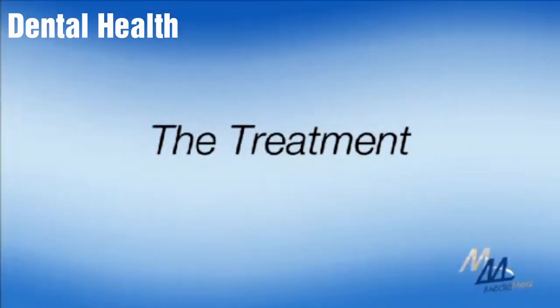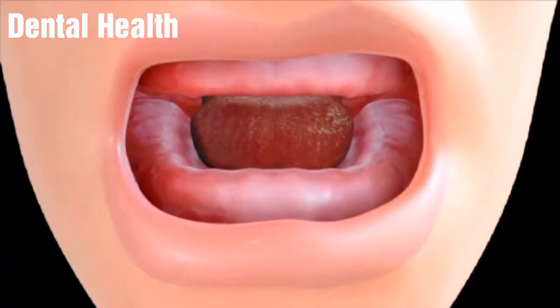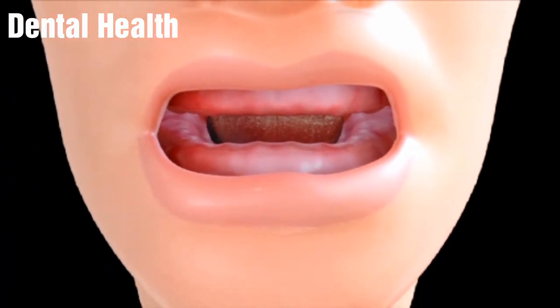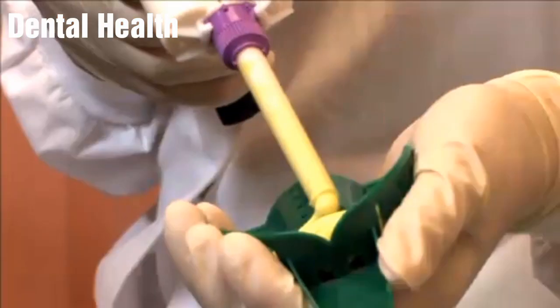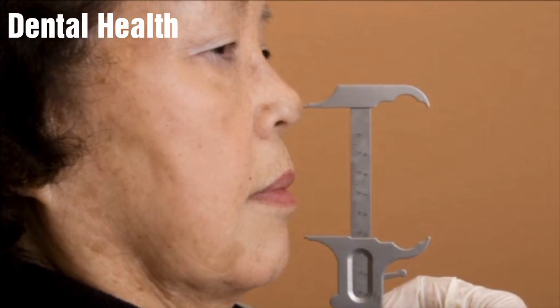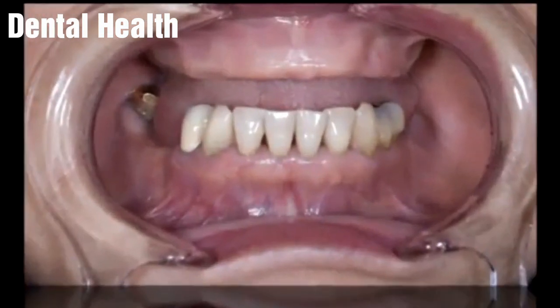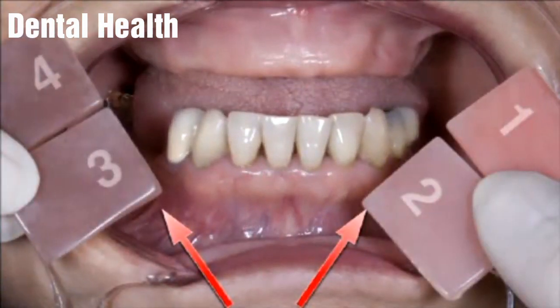Complete dentures are made using your mouth as a model. First, your dentist will take an accurate impression of the upper and lower arches of your mouth. This impression is then sent to the dental laboratory. At the next visit, your dentist will record the relationship of the arches that best resembles your original bite and helps you select the shape and color of the denture teeth and gums.